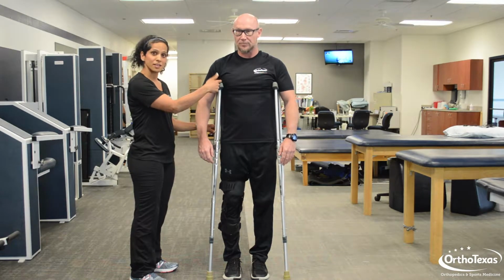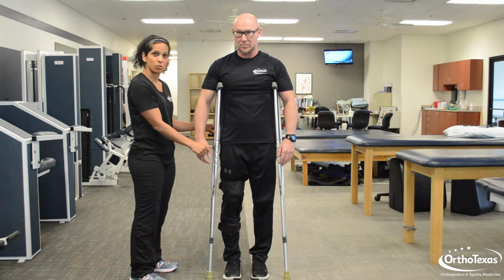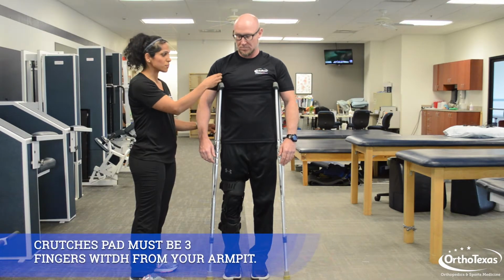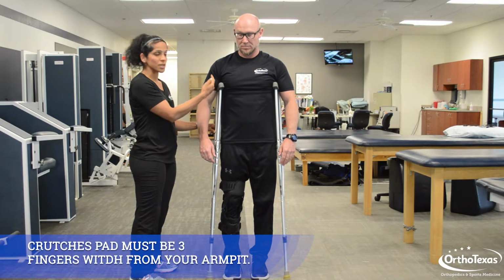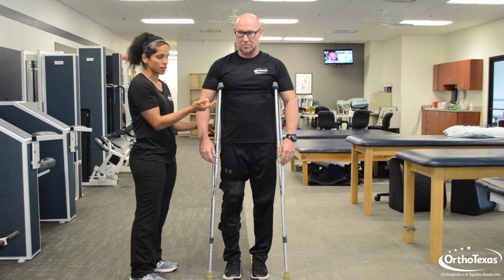First is the pad that goes right under your armpit, and then the handles that your hands are going to hold on to. So we'll first talk about the pad. The pad has to be 3 fingers from your armpit, not shooting into the armpit, but 3 fingers down from the armpit. That way you prevent any kind of nerve injury on your arms.